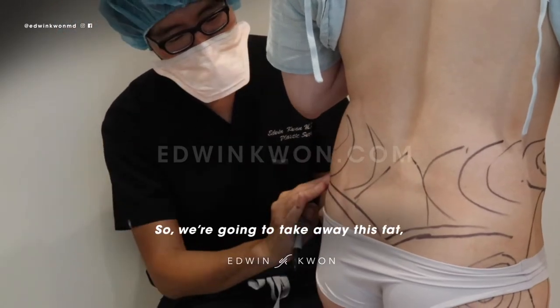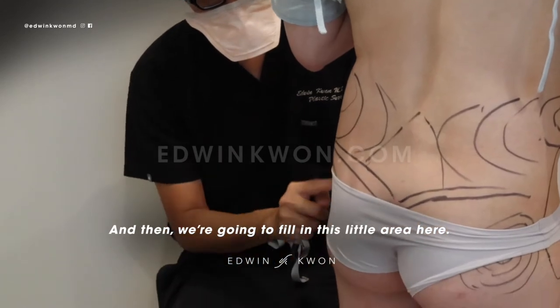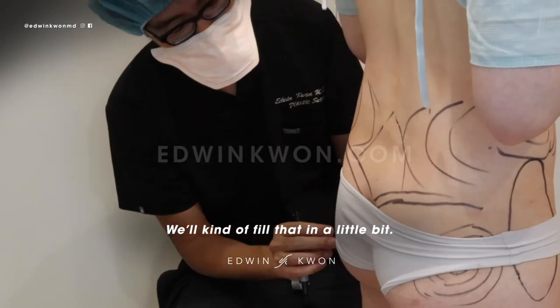That'll make it pop. So we're gonna take away this fat along when we're taking this. And then we're gonna fill in this little area here. So when we put the implant here, it's gonna exaggerate this more. We'll kind of fill that in a little bit. All right.